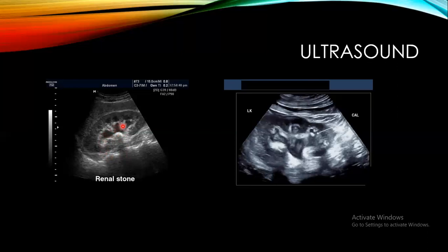بالمقابل الموجة الصوتية لها قابلية الانتقال بالفلود very easy without any echogenicity or without any echo wave. يعني مثلا إذا كان عندي أي منطقة بها فلود، هذا الفلود إذا كان يورين أو ووتر، فراح نشوف الموجة الصوتية تنتقل به بسهولة وبدون أي ارتدادات.